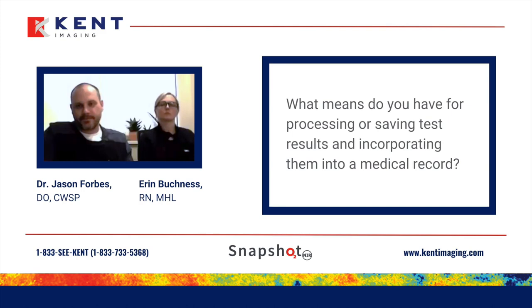First question we had is regarding integration of the results of this test with your EMR. What means you have for processing or saving the test results and incorporating them into your medical record? We load them currently into the patient chart. We are a Healogics clinic, so it goes into the actual wound assessment right now. So that will be a permanent part of their medical record.